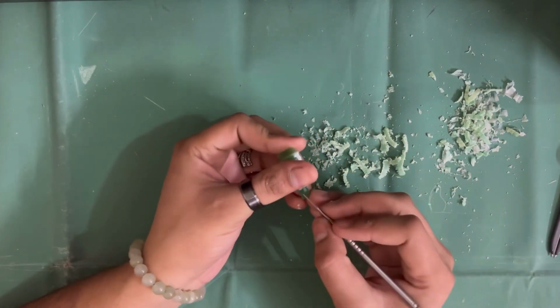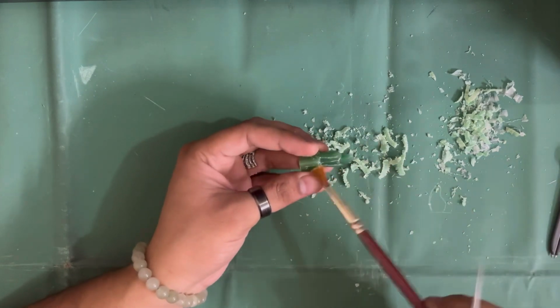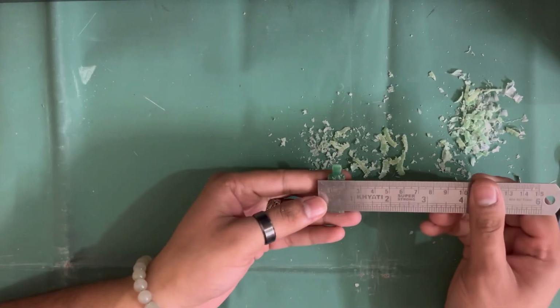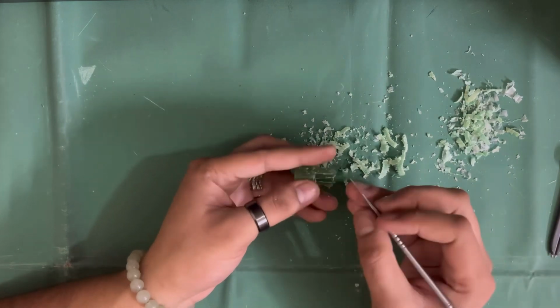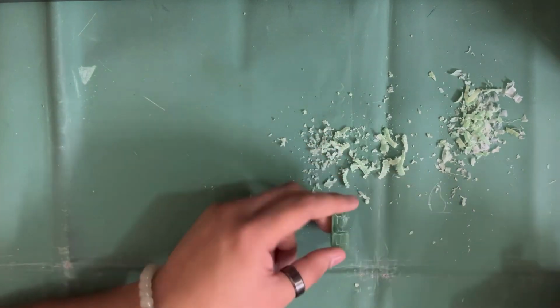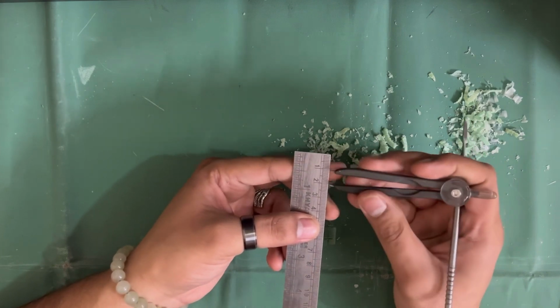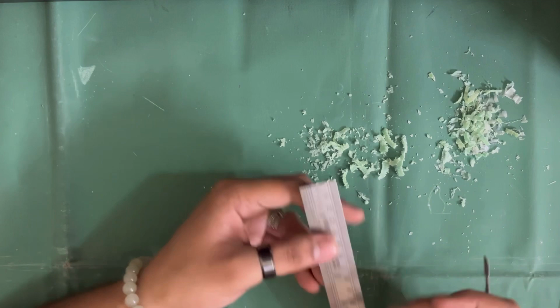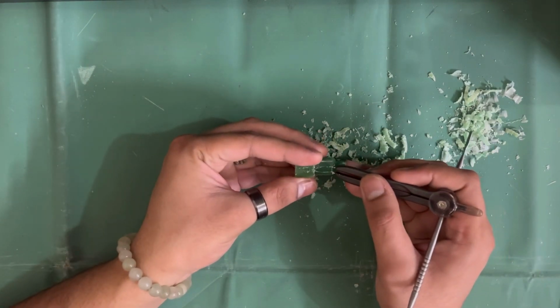Now we will move on to the root, mesial and distal side. Don't forget to keep on checking the measurements in between so that you don't lose dimensions.